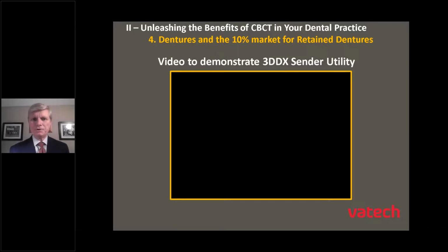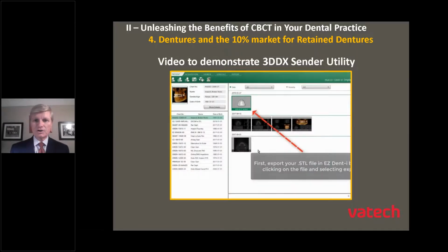So in this video, again, I want to help identify how quick and easy it is to incorporate and partner with companies such as 3D Diagnostics to help you implement this type of treatment planning within your office. Again, we're going after that 10% of the market that are wearing removable dentures, and reducing that percentage by going with implant supported dentures instead. So let's go ahead and start here.